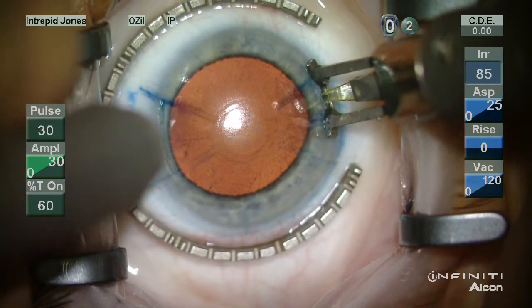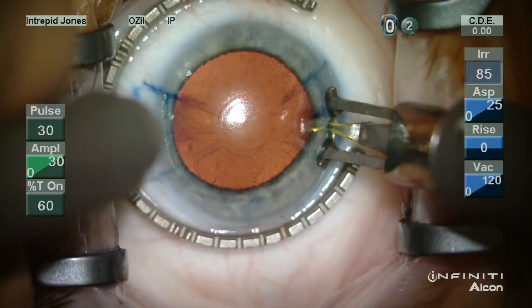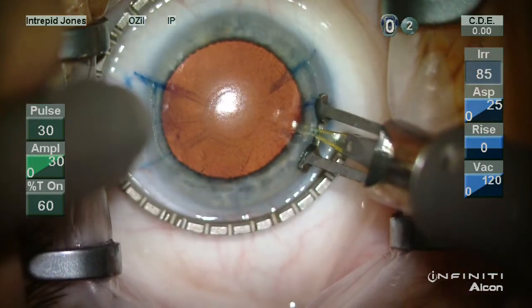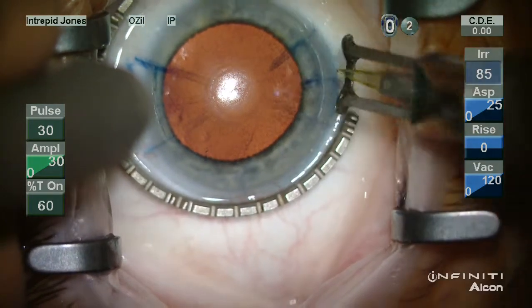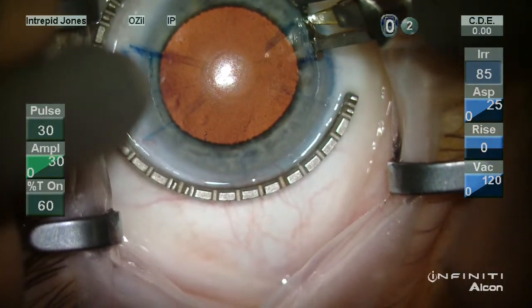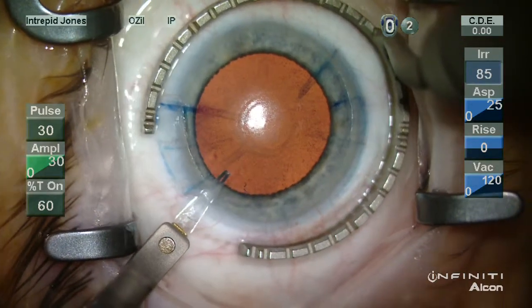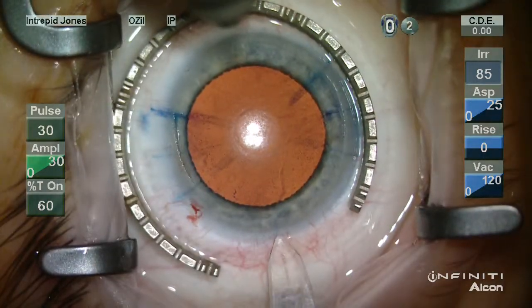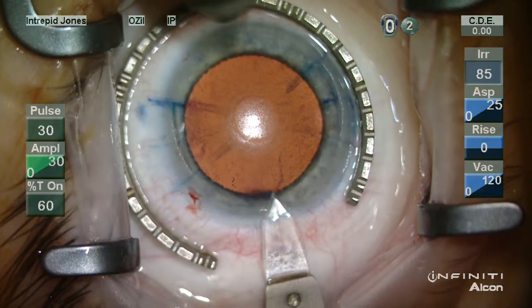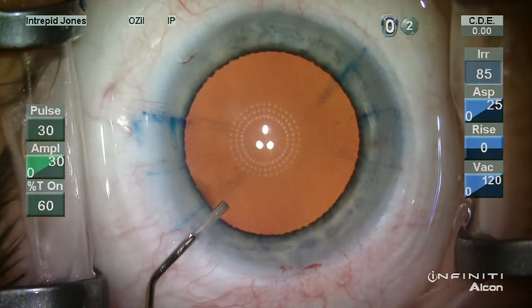drawing the blade towards the surgeon. A slight rotational movement. I tend to find that epithelium is usually loose in one side, not both, although this can be the case to have both loose, so it's good to be aware of this potential issue. And once again, the main wounds and the paracentesis are placed outside of these relaxing incisions. And at the conclusion of the case, or after this LRI, you can note the roundness of the keratoscopic view.